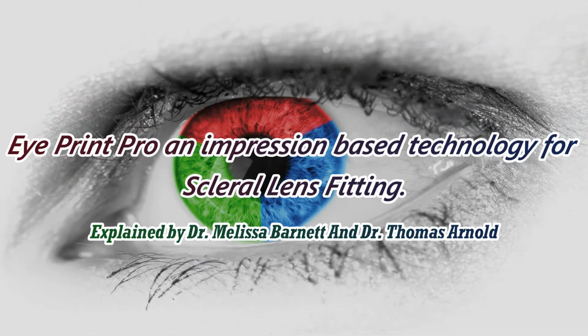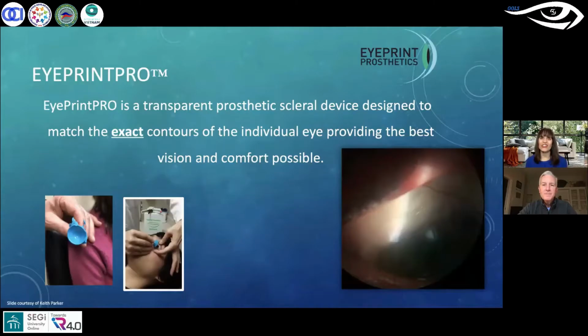Another problem solver is the EyePrint Pro. So this is an impression-based technology. It's a transparent prosthetic scleral device that matches exactly the contours of the eye. I like to talk to my patients and tell them that it's a very customized technology, like the most custom fit glove or dress or whatever it might be. And it is used to create the best vision and comfort possible for a patient.